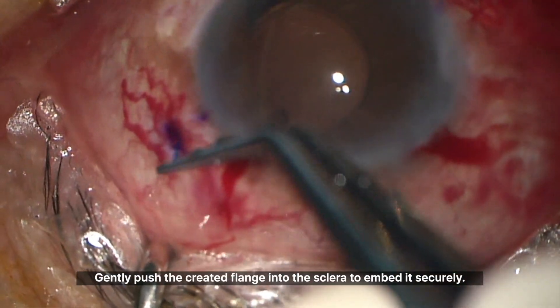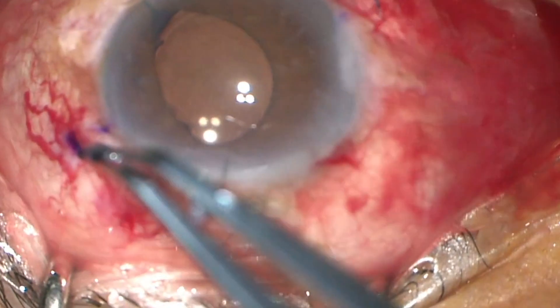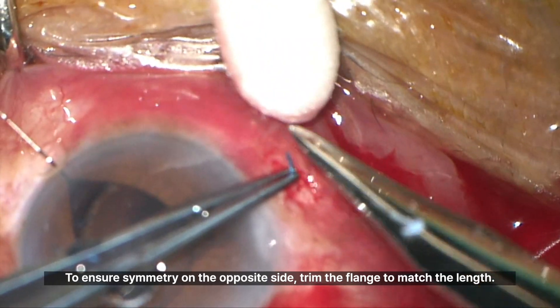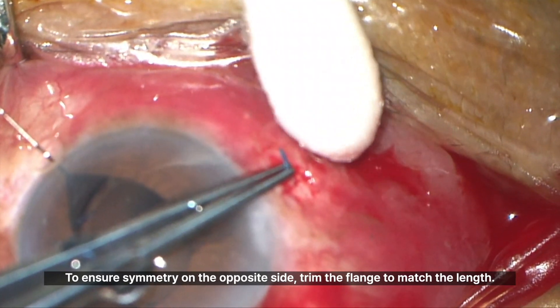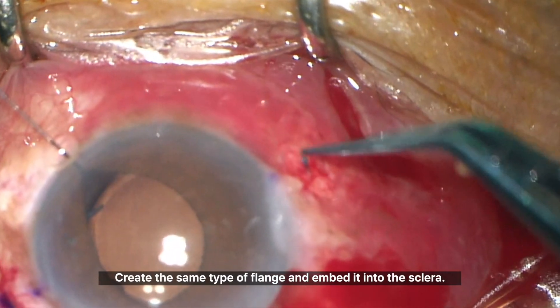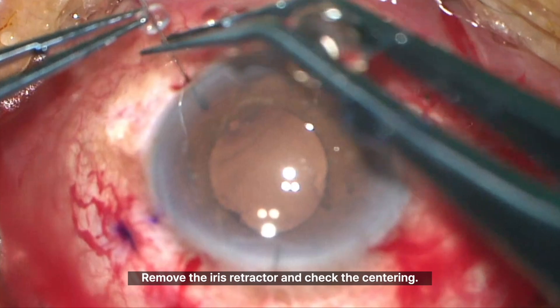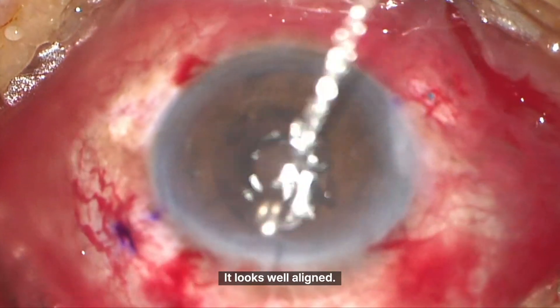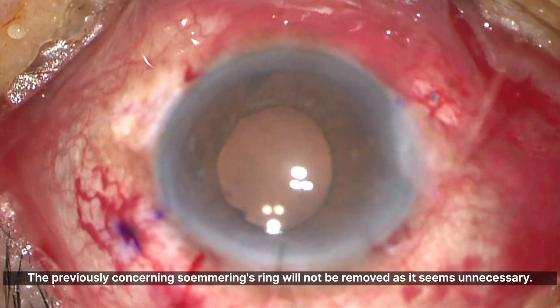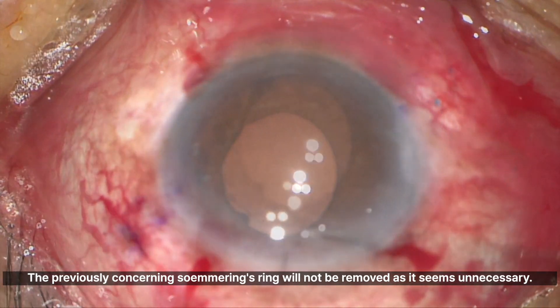Gently push the created flange into the sclera to embed it securely. To ensure symmetry on the opposite side, trim the flange to match the length, create the same type of flange, and embed it into the sclera. Remove the iris retractor and check the centering — it looks well aligned. The previously concerning Sommering's ring will not be removed as it seems unnecessary.